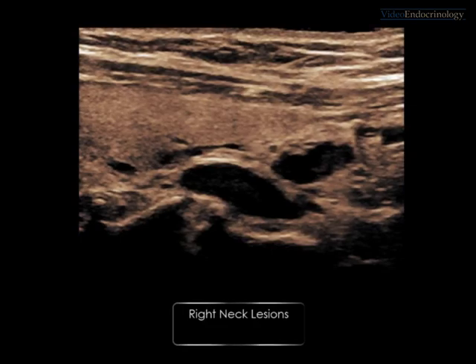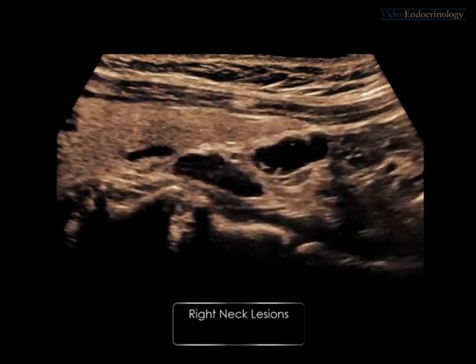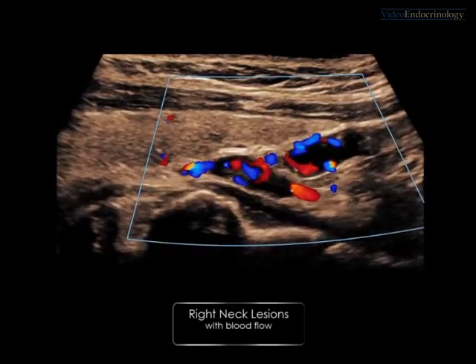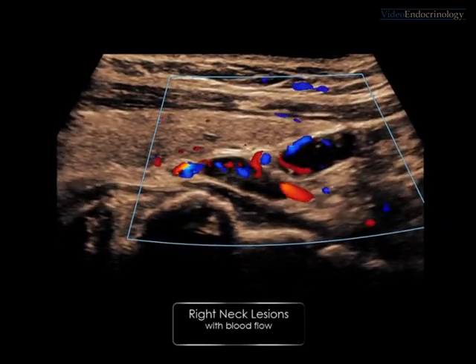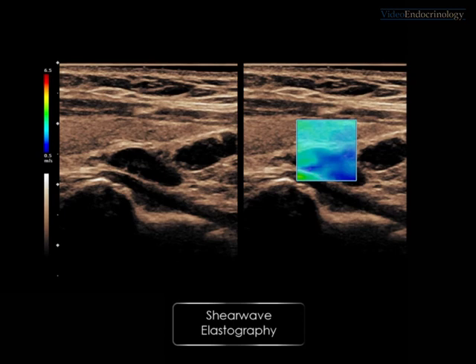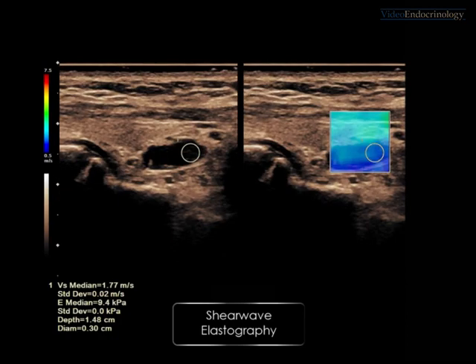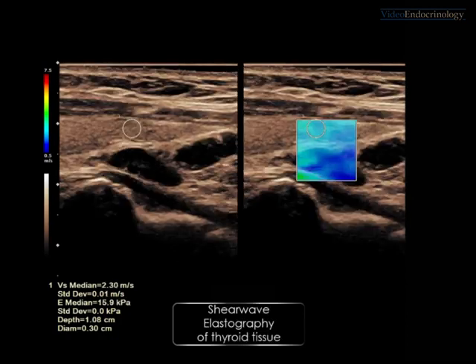Her neck ultrasound showed two lesions posterior to the thyroid lobe. Both lesions showed blood flow and resembled parathyroid adenomas. The shear wave velocity measurement for the superior lesion was 1.67 m per second and the inferior lesion was 1.77 m per second. The shear wave velocity for the adjacent thyroid tissue was significantly higher at 2.3 m per second.